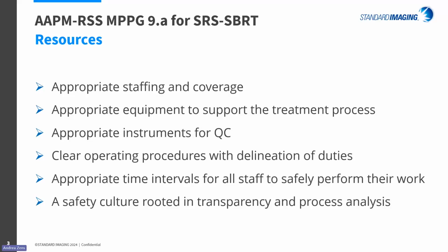And as well, you need the appropriate instruments, QA devices, and software to ensure proper safety and functioning of all that said equipment. Clear operating procedures with delineations of duties, and certainly a safety culture rooted in transparency and process analysis are all required to have a highly successful and safe stereotactic program.